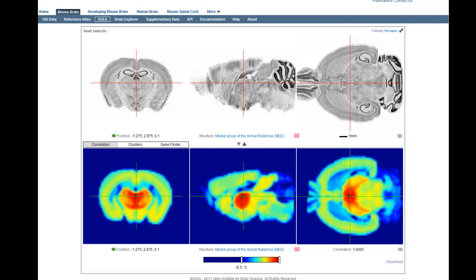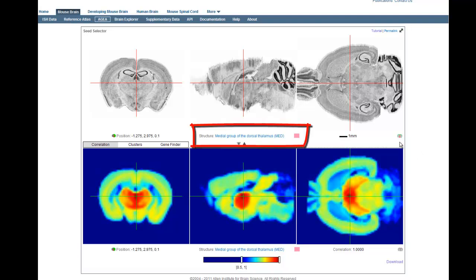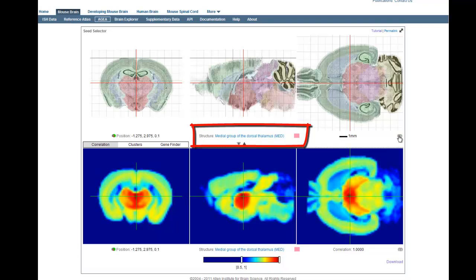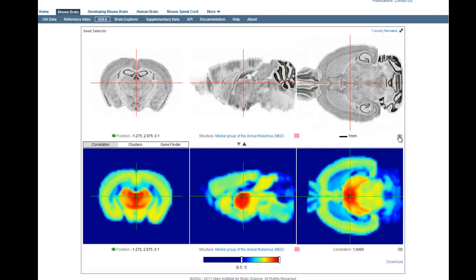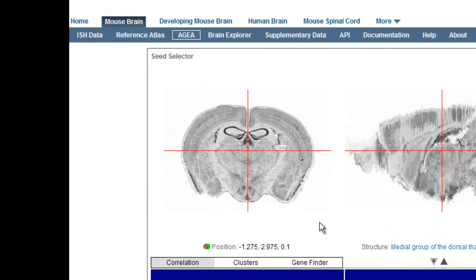The top three panels show coronal Nissl sections either straight on or used to construct the sagittal and horizontal planes of the mouse brain. To orient yourself to the areas of the brain, you can use our structure ontology, click on this icon to overlay the color-coded reference atlas sections, or go to the coronal reference atlas plate by clicking on this icon.